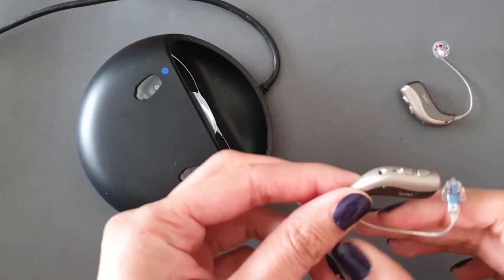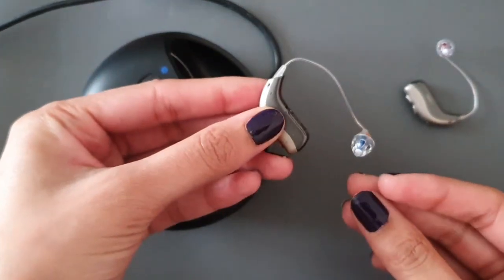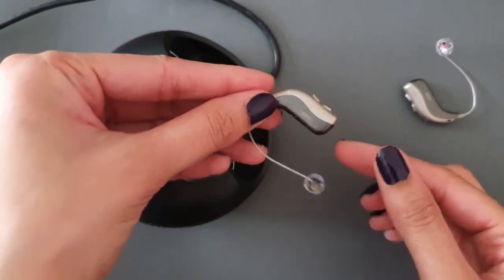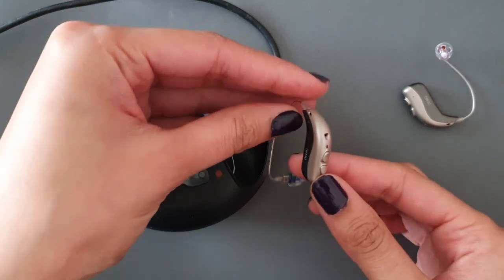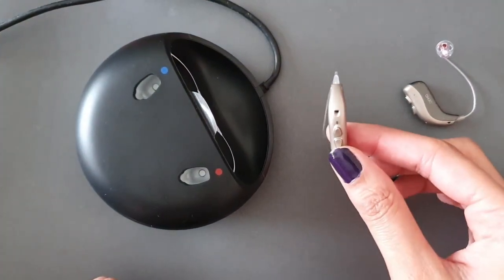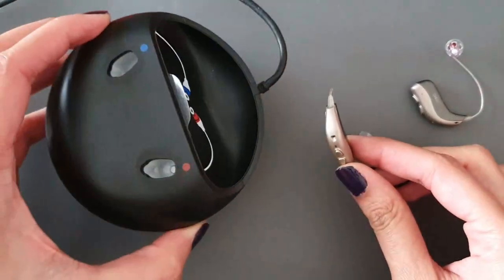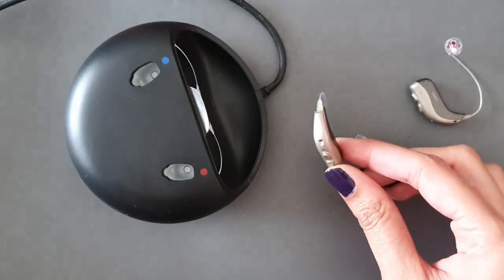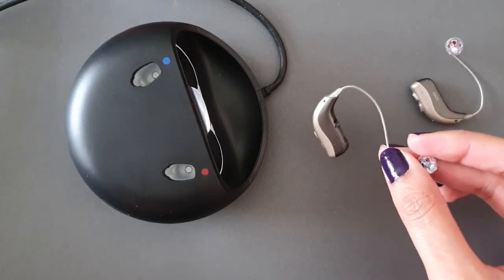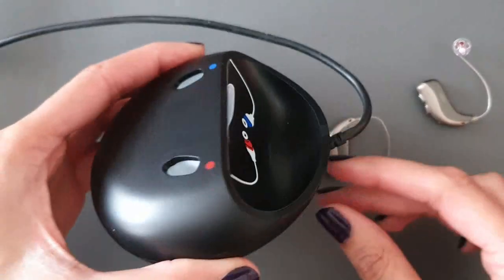This is the Bernafon Viron rechargeable hearing aid, which means inside the instruments there's a built-in lithium-ion battery. That means every night when you take the hearing aids off, the hearing aid docks into your charger to charge the instruments up overnight, which will ensure you have the hearing aids lasting throughout the whole day.